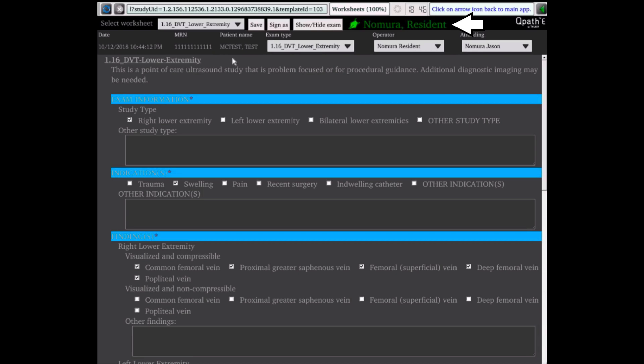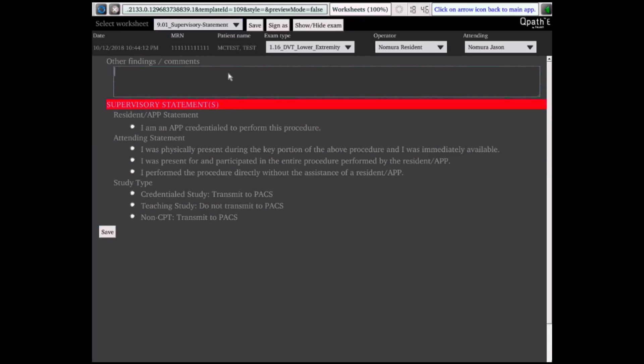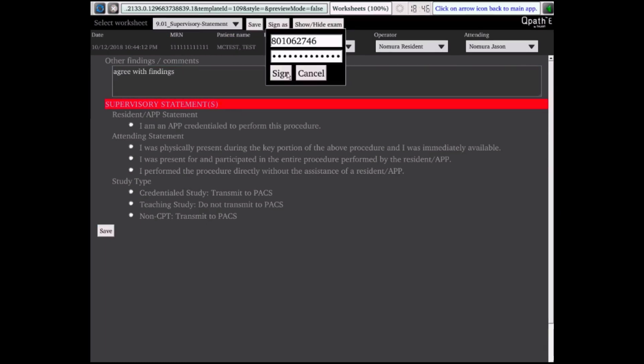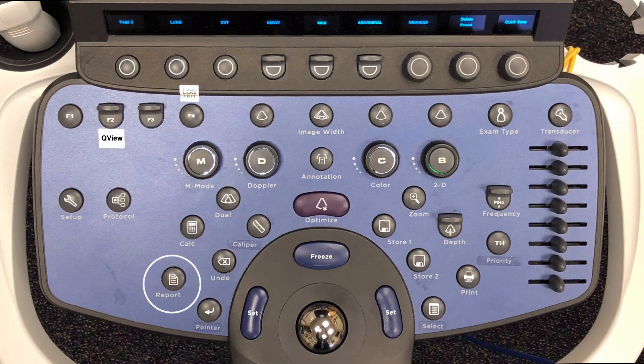Only one person has signed the worksheet in QView. If you are an attending or APP, you will have to complete the supervisory statement. If you have not signed the exam worksheet, click Save to save what you have filled out. To change to the supervisory worksheet, click on the drop-down menu for the worksheet — the drop-down will display the two active worksheets. Select and highlight the supervisory worksheet. Note that QView cannot display both worksheets at once like in QPath-E on a workstation. Complete the supervisory worksheet with the required APP or attending statement and study type, then click Sign As — enter your 801 ID and password and click Sign. Note that the barcode scanner does not work in QView. The worksheet is now signed and saved, shown by the pen icon and name listed. To exit QView, click the arrow button in the far right corner of the screen, or press the Report button.